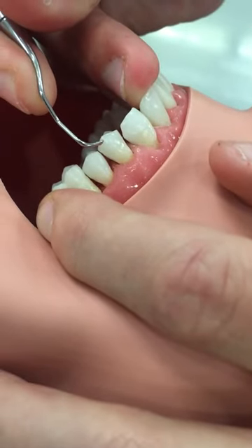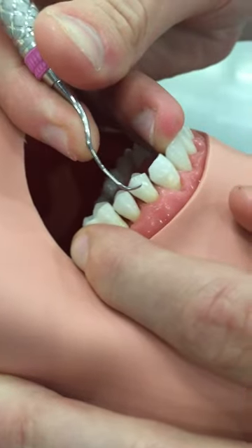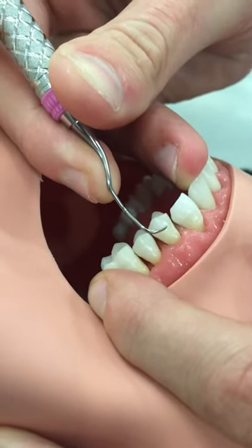Hey guys, we want to teach you something that a D2 or D3 came in and taught us. I've got Bryson here with me and we're going to go over the different stroke types, but we're going to show you a trend that we've noticed that kind of guarantees that you get the right stroke every time and you don't touch the wrong tooth with the wrong instrument.